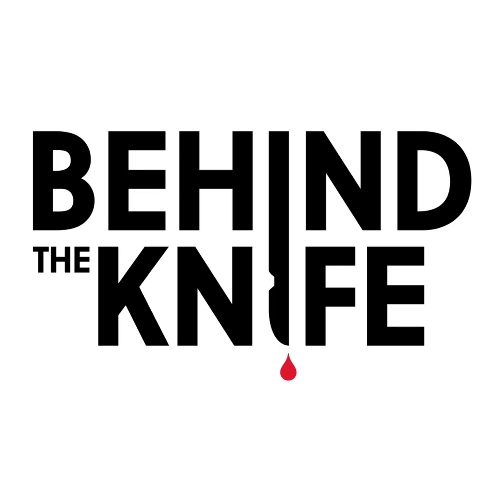And I'm going to tell you why that is. Because a 30 by 30 turned like a diamond is 43 on its long axis. And the reason why we like the bigger meshes is because they're square and they fill the top and the bottom better. And a 43 will almost always get you from under the xiphoid to behind the pubis. So 43 by 43 squares, heavyweight polypropylene, large pore, 70 to 90 grams per meter squared. That's what's missing. That's what we need. Let's start putting some of that stuff in.